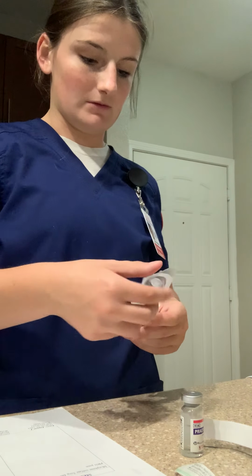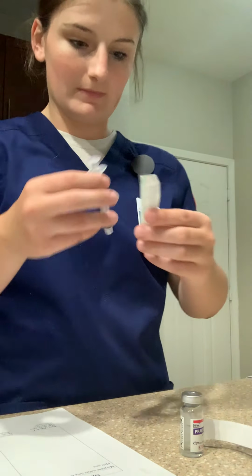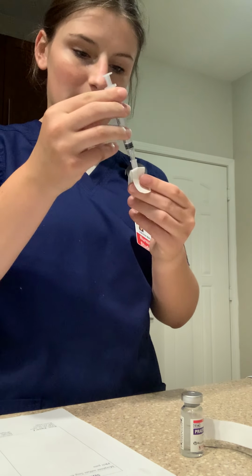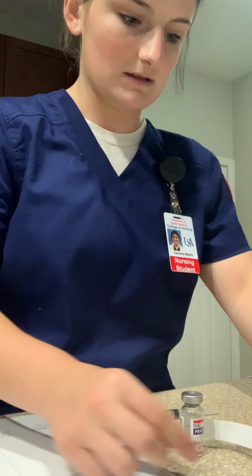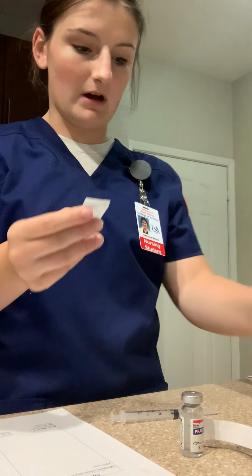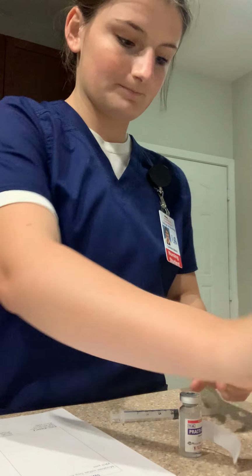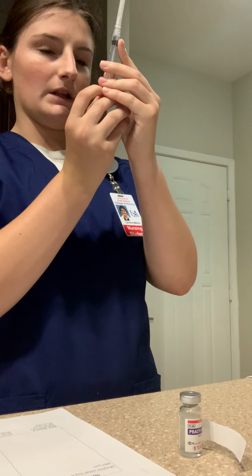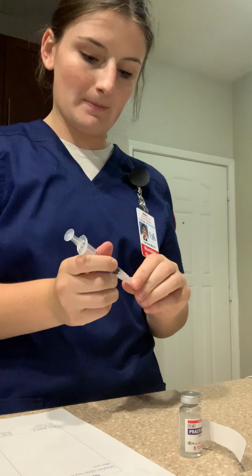So I'm going to take out my syringe and my cannula. I'm going to place that on the side so as not to contaminate. I'm going to clean my vial, going in a circular motion. I'm going to draw back 0.5 milliliters of air.